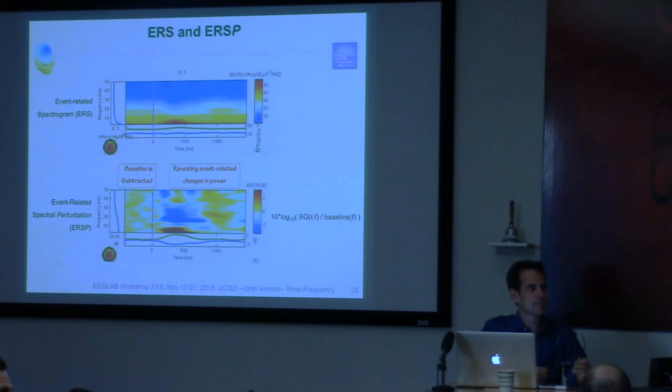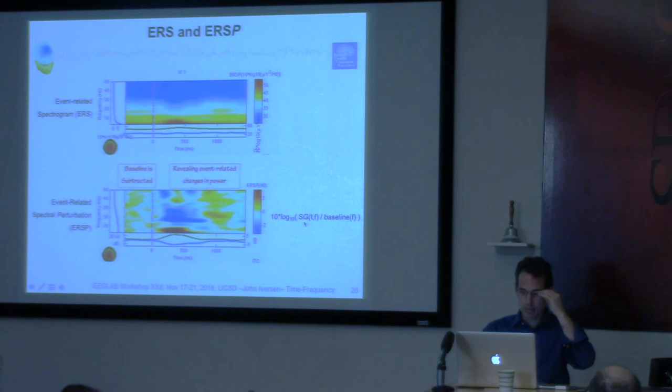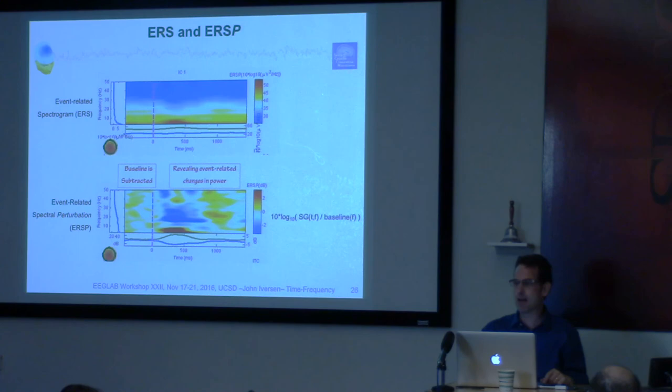Thanks for that. So that's basically saying, why are we doing a ratio of powers rather than just subtracting off the baseline, like you're typically doing with ERP. So hopefully that helps. You can play with the different options in the GUI. We can talk about that later too. Any other questions?